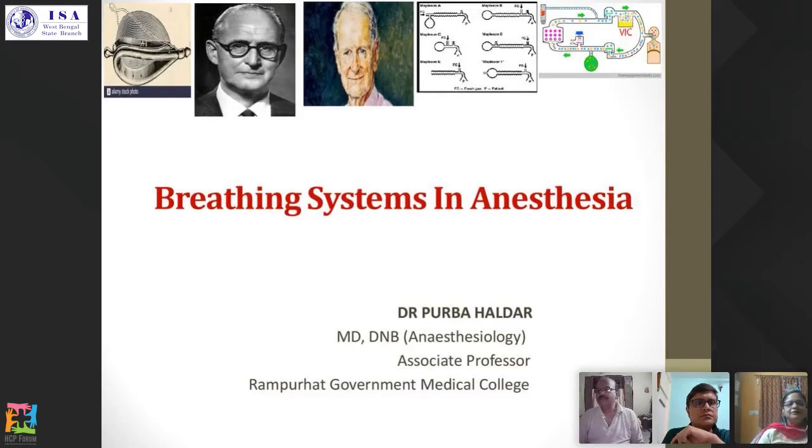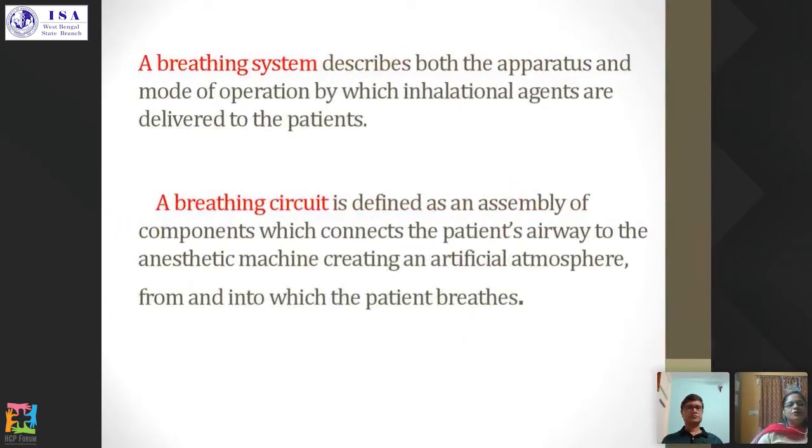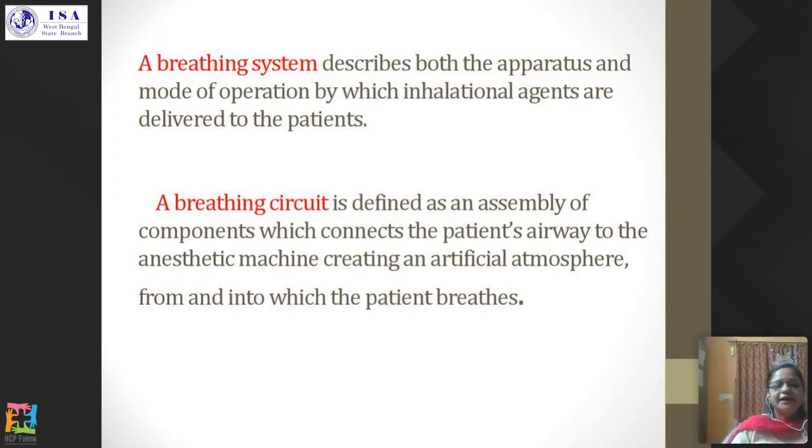Now today's presentation: the breathing systems in anesthesia. What is the breathing system and what is the breathing circuit? First, the definition. The breathing system describes both the apparatus and the mode of operation by which the inhalation agents are delivered to the patients. And the breathing circuit is defined as the assembly of components which connect the patient airway to the anesthetic machine, creating an artificial atmosphere from and into which the patient breathes.